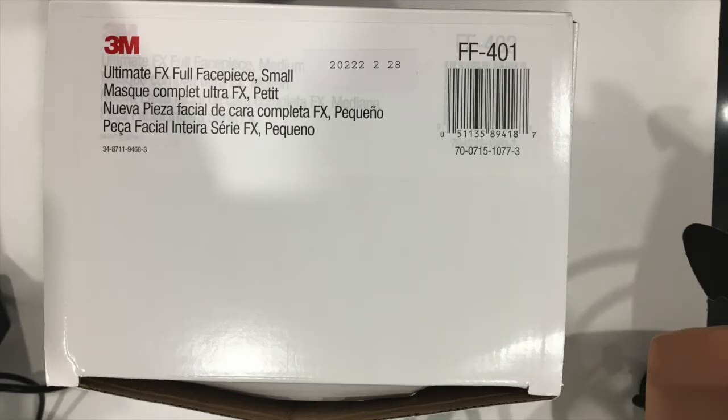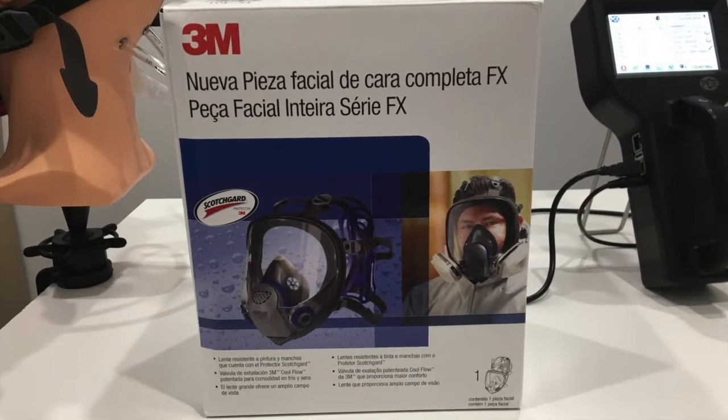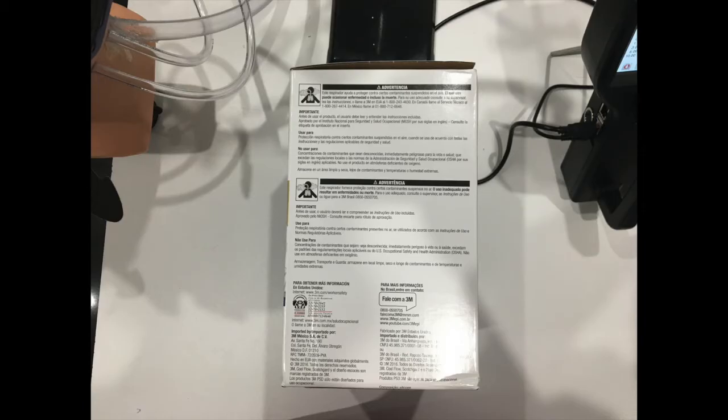Here are some photos of the box from the top, from the front, from the back cover, and from the two side covers.